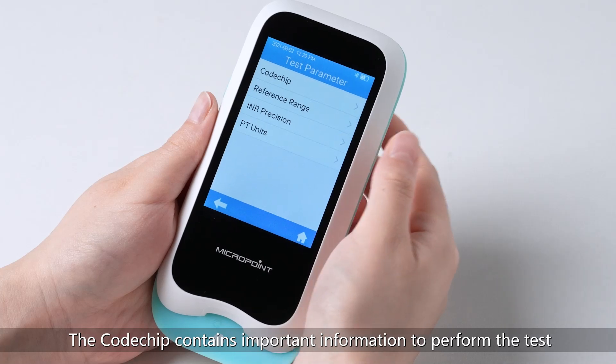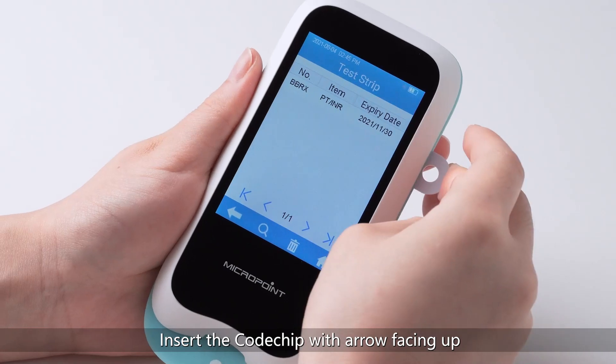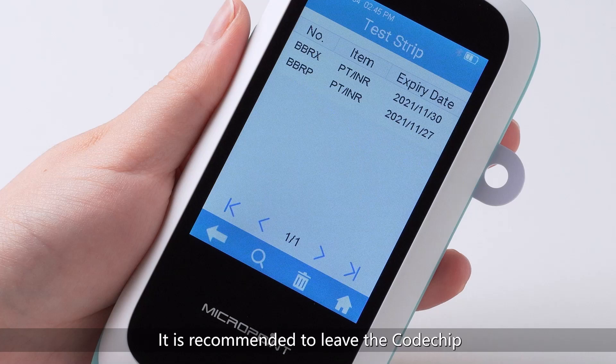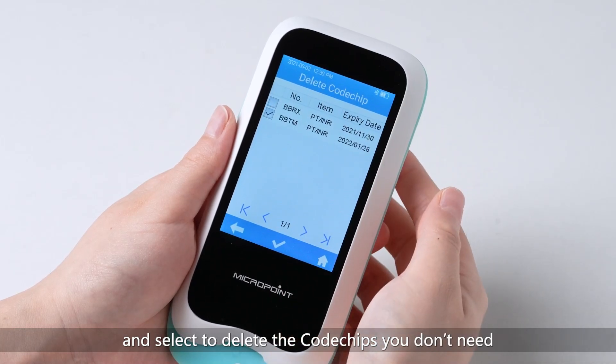The code chip contains important information to perform the test, including the test item, code chip number, and the expiration date. The code chip is required whenever a new test strip lot is used. To insert the code chip, click Test parameter from Settings and then click Code Chip. Install the new code chip by inserting it into the code chip slot with the arrow facing up. The code chip information will be automatically installed and displayed in the list. It is recommended to leave the code chip in the slot to protect the electronic contacts from moisture and magnetic fields. If necessary, click the bin icon to delete code chips you don't need.